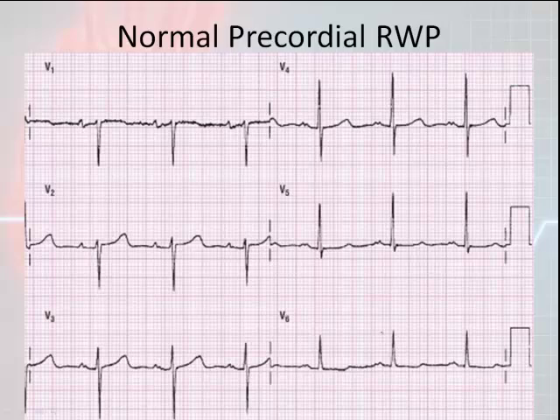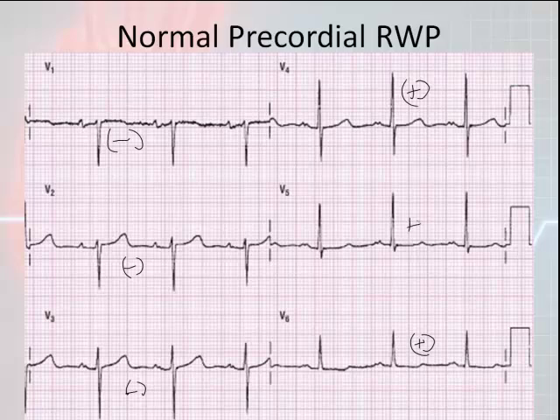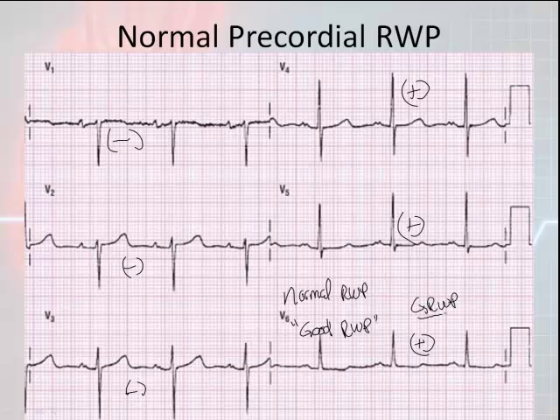This EKG shows a normal R wave progression. V1 starts primarily negative, and V6 ends primarily positive. Following through: primarily negative in V1, negative in V2, primarily negative in V3, then transitioning to positive in V4, positive in V5, and positive in V6. This is considered normal R wave progression. On a 12-lead printout you might see it abbreviated as GRWP — good R wave progression.